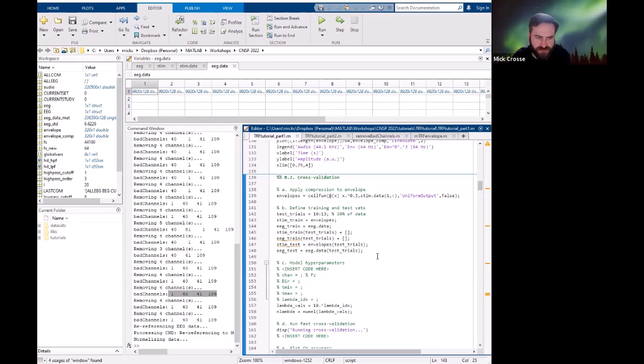There's a lot of noise in EEG, so there's a lot of stuff you can overfit to there, and we have to mitigate overfitting as much as possible. So that's why we'll cross-validate over a number of different parameters to ensure that we don't overfit.